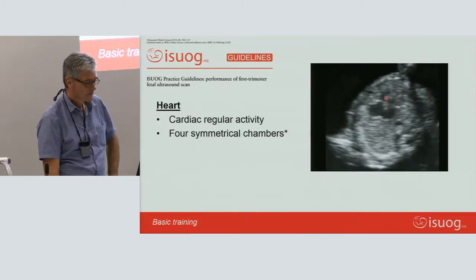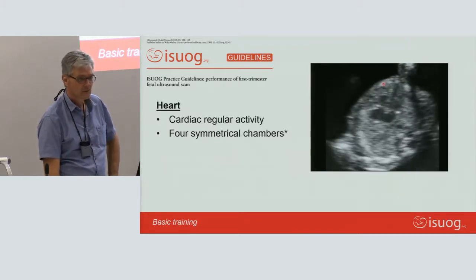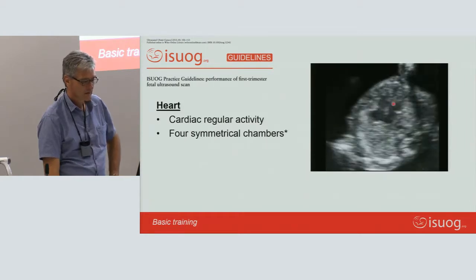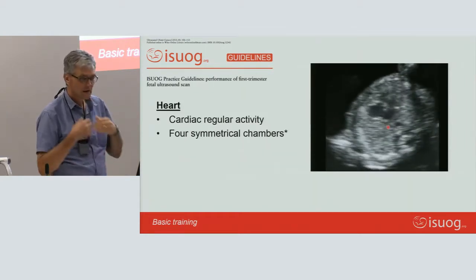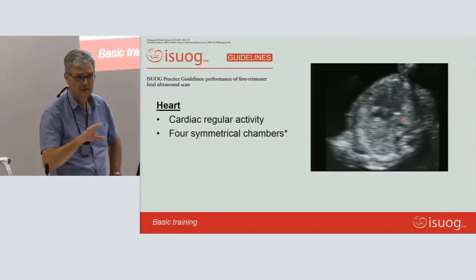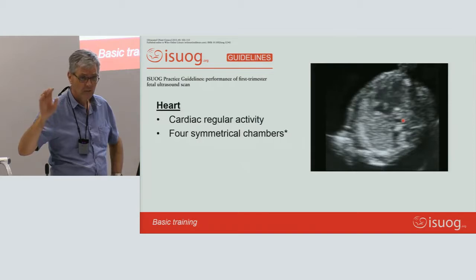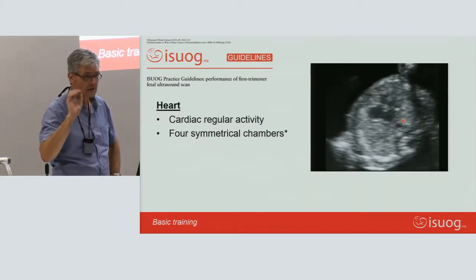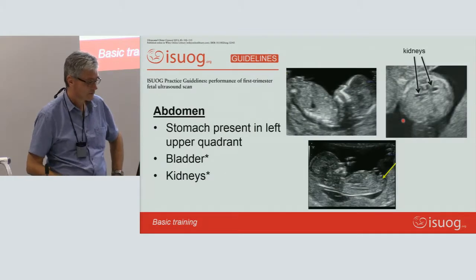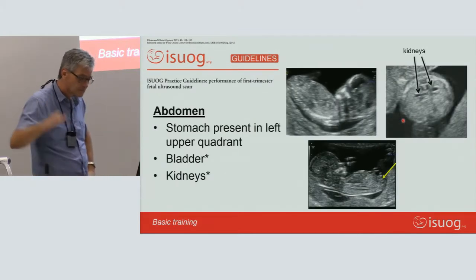In the heart, you see nice equal size right and left chambers, the valves opening and closing and beating along nice and regularly. And you'll notice there's nothing about putting on M-mode or pulse wave. If you see it, that's actually fine. That's what you want to see at this basic level.